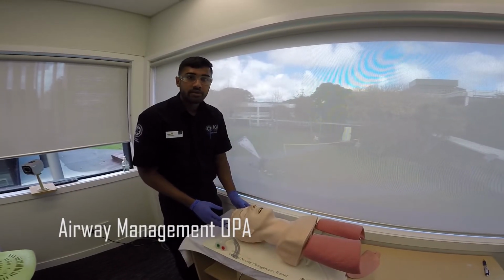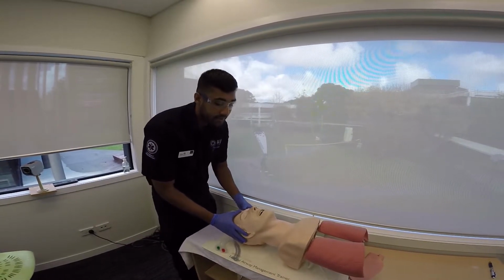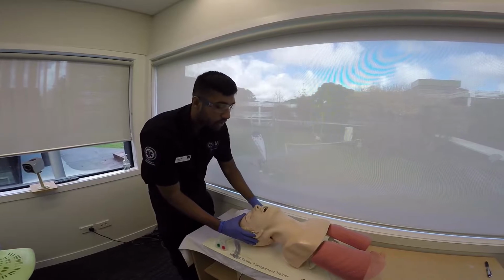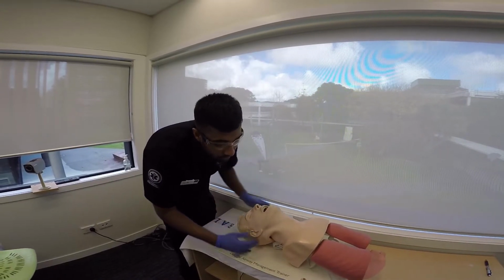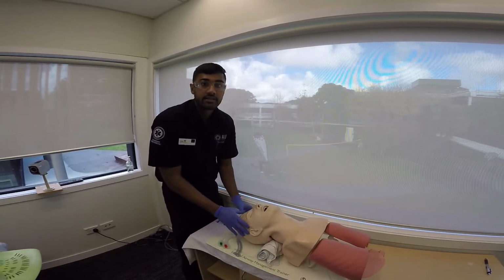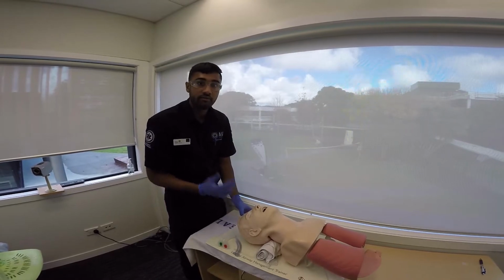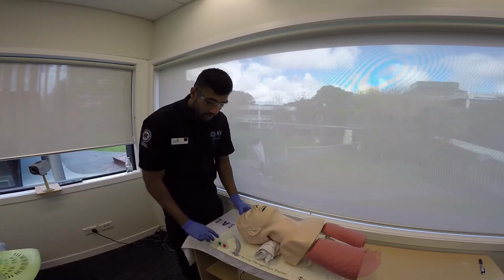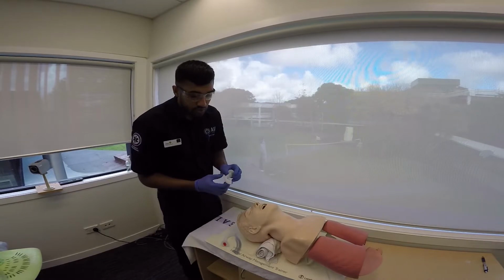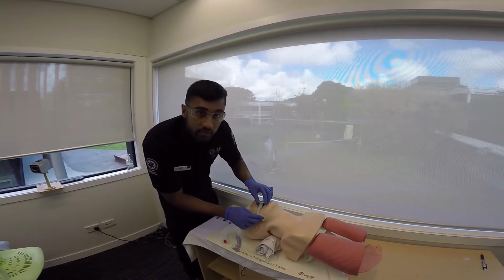For basic airway management, we can use adjuncts such as an NPA or an OPA, as well as using a head tilt chin lift position like so, while placing a towel behind the patient's neck. What this does is it helps maintain a good airway position, as well as preventing the patient's tongue from falling back into the oropharynx. To measure an OPA, you want to measure it from the corner of the patient's mouth to the corner of the mandible.